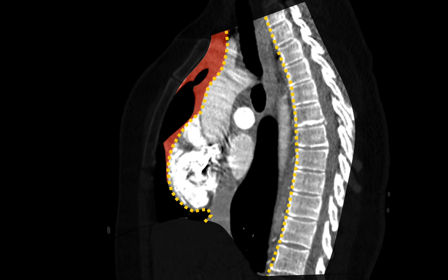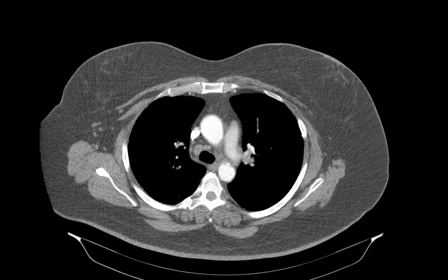For this talk, we're going to be discussing the anterior mediastinum, which some people say is home to 50% of mediastinal masses. The anterior mediastinal space on an axial CT extends from the sternum to the anterior surface of the great vessels and heart, and it extends as far lateral as the internal mammary vessels.